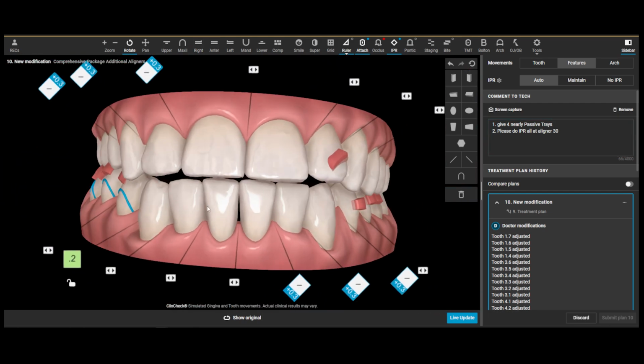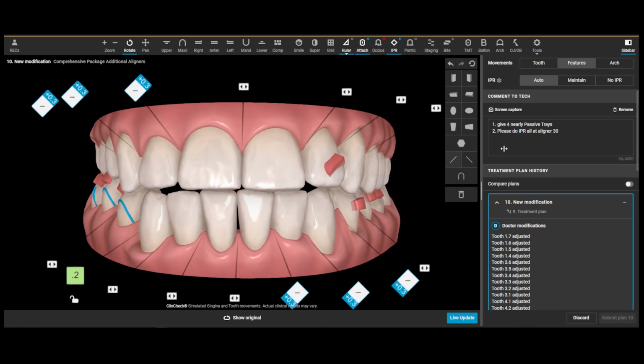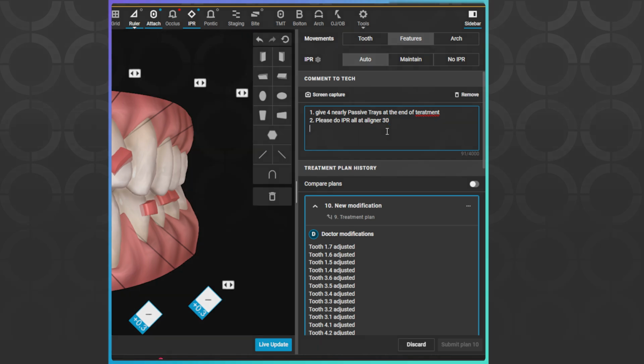But essentially, those were all the changes that I just made in 3D so that we can make it ourselves. And the only thing that's left for the technicians at this point is 2 instructions. And those instructions are, give us 4 nearly passive trays at the end of treatment. And please do all of the IPR at aligner number 30. The beautiful thing about this setup is that the technicians now literally, I don't want to say can't screw it up, but there's not a whole lot that they can do wrong because we just took control ourselves.